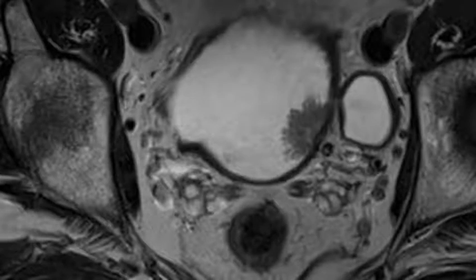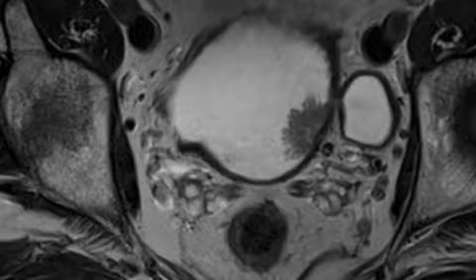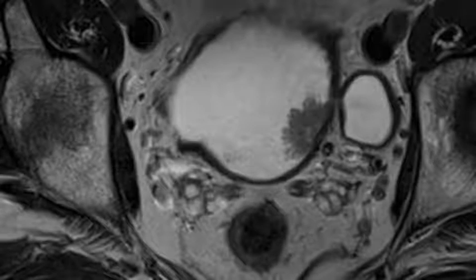At a fixed bandwidth, the pixel width of the band-like artifact widens as field strength increases, which can limit the visualization of disease, particularly around the bladder wall. This artifact appears as a thickened, dark line along the lateral bladder wall on one side and as a bright line on the contralateral side.